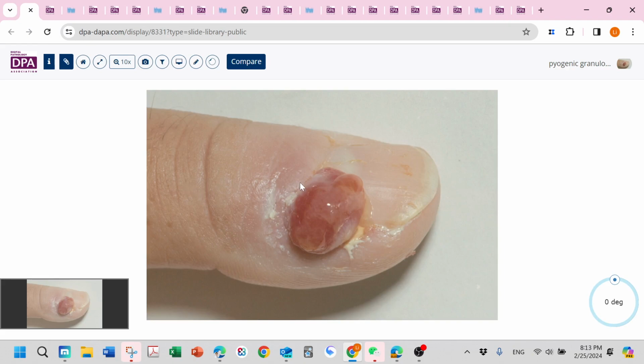And then the other vascular lesion, hemangioma, is called the pyogenic granuloma, aka lobular capillary hemangioma. The gross picture is an exophytic, really red, vascular rich nodule, usually in the distal extremity and even in the lip, in the head and neck area.